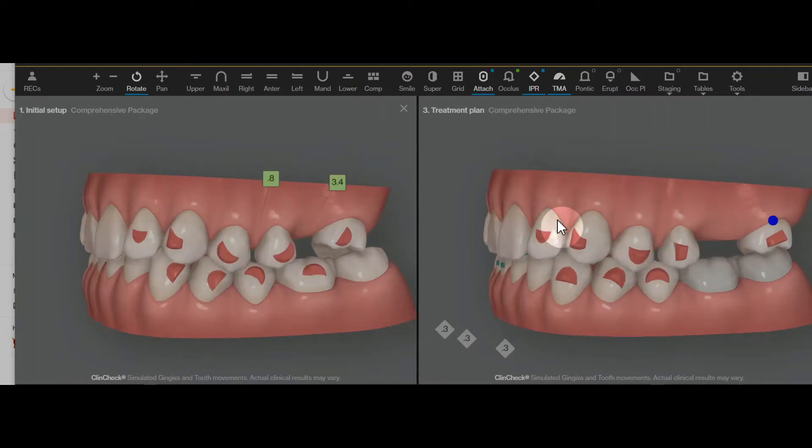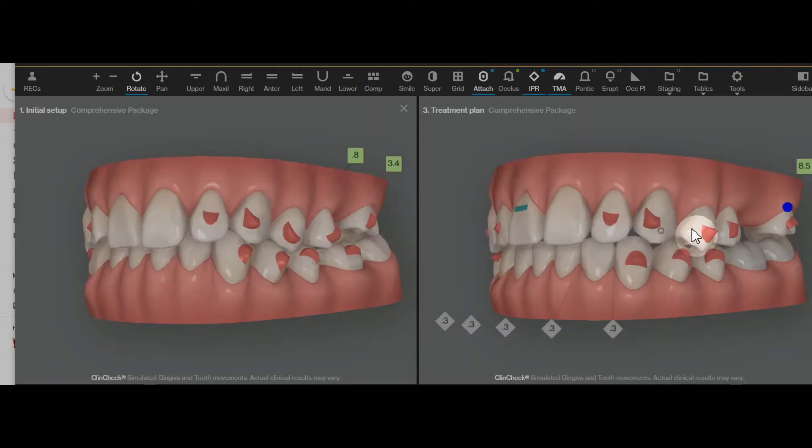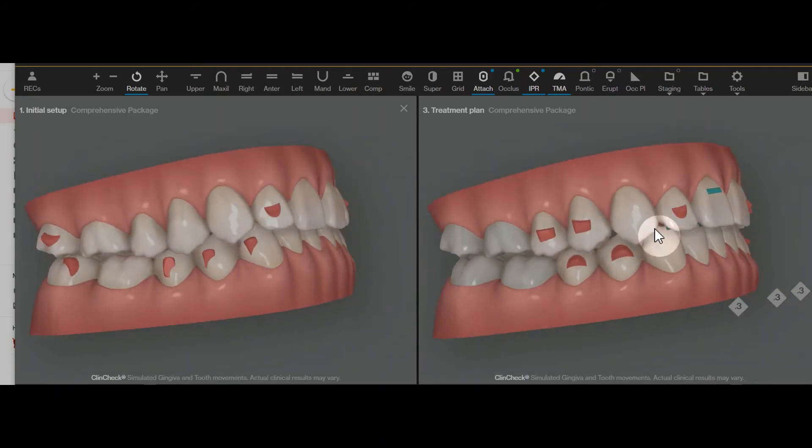It really shouldn't affect the upper anterior in any positive way because it's just too far away geographically in the mouth. The implant placement is not going to negatively impact the rest of the tooth movement, and moving the teeth with aligners is not going to delay the integration of the implant in any way. Hopefully you get to the end of the case and the implant only has a little bit longer to heal, then you're ready to place the implant crown and put a retainer on everything else.